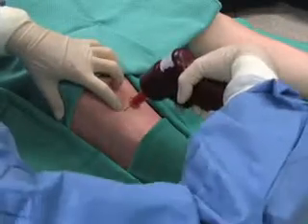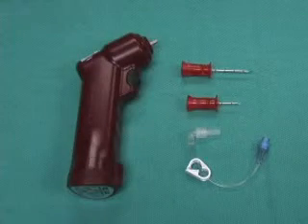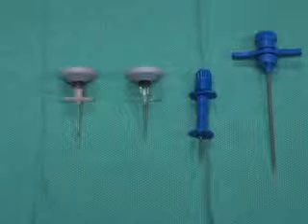This video describes the placement of an intraosseous needle in adult patients. The use of both a mechanical drill-based device and manual insertion will be demonstrated.